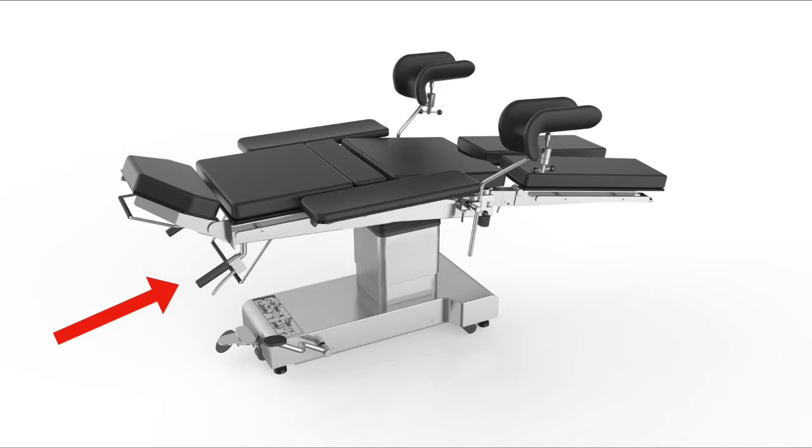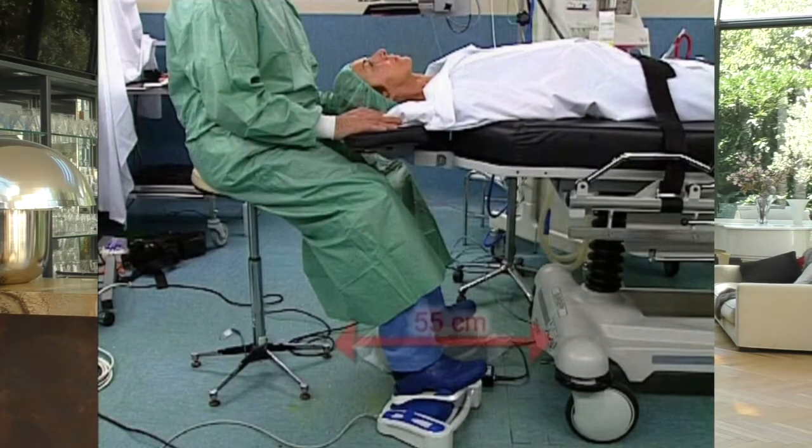I had and still have long shins. At the time, I operated with a table that had a system at the front to position the patient's head, but which did not allow the surgeon's legs to move freely. It also had a base that prevented the pedals from being placed in front of the surgeon — they had to be placed on either side of the base. Working with legs spread apart was my first serious mistake, because it leads to a position of the pelvis displacing the entire vertebral stature. After my accident and six months of wearing a neck brace from skull to pelvis, I calculated that we need about 55 centimeters of free space in front of the table base to place the pedal.